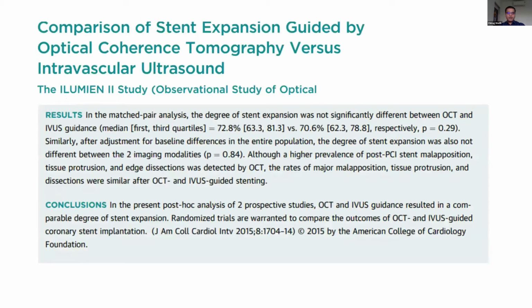So over a period of years, whatever principles we have learned from IVUS have been applied to OCT, and it has now been shown that the results of stent expansion derived from OCT are almost comparable to what IVUS could achieve, and therefore OCT is almost non-inferior to IVUS.